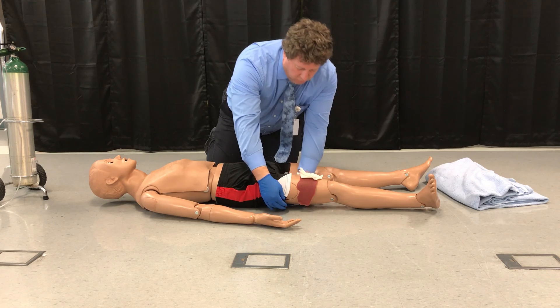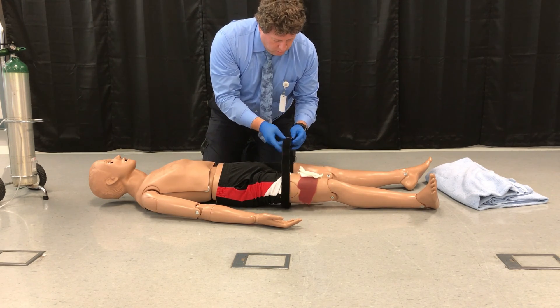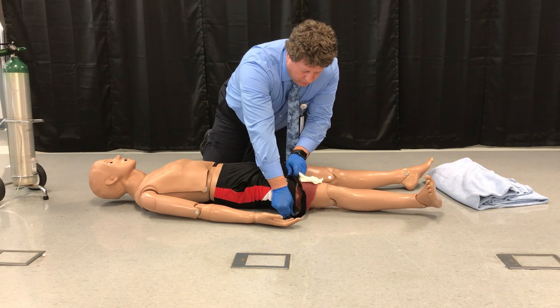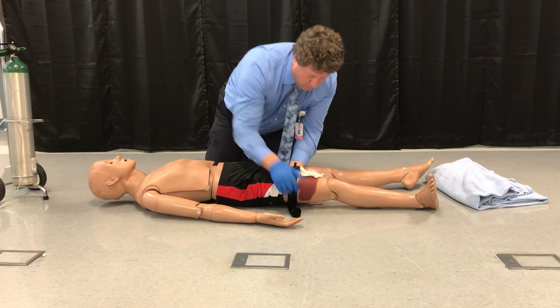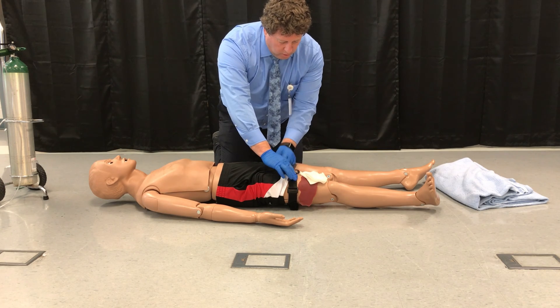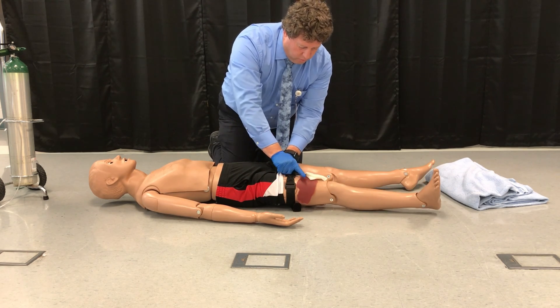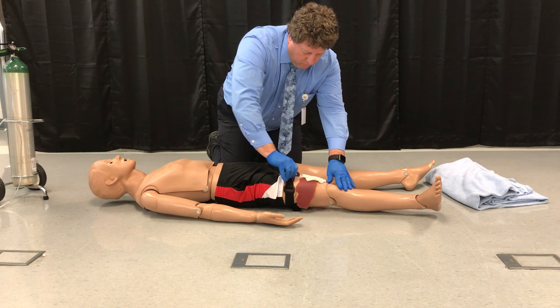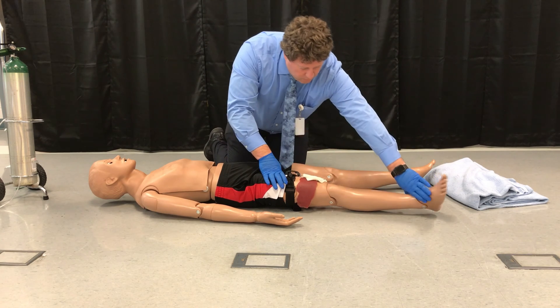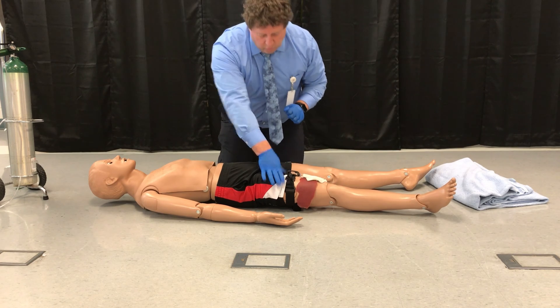I put a tourniquet around his leg about 2 inches above the injury. I will pull that as tight as I can. I will then take the windlass and twist it — generally 2 to 3 times will be sufficient — but I want to twist it until bleeding is controlled and I no longer have a distal pulse. Bleeding is controlled at this time.